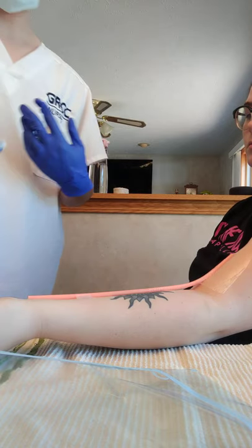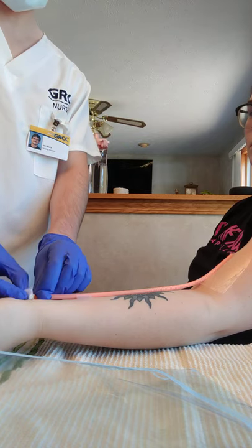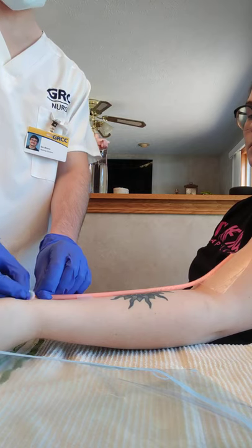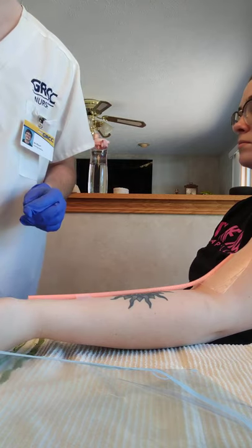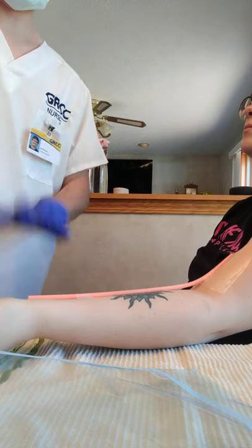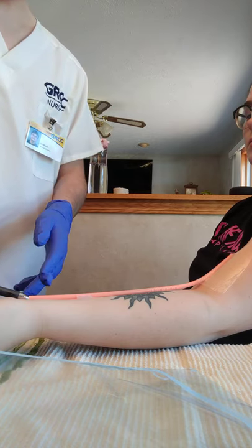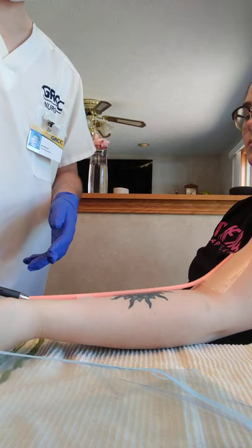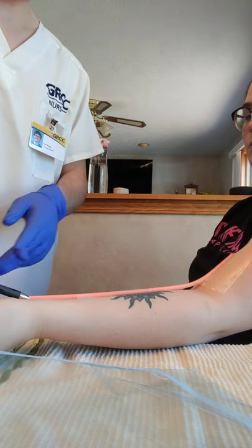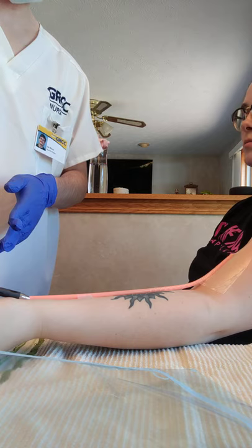Next, I'm going to inject the locking solution. So again, I'm going to clean the port for 5 seconds at a minimum, if not longer. And then I'm going to take my 10 milliliter syringe of locking solution after I've let that dry. So I'll hook this up to the needleless port access device and unclamp the clamp on the catheter and slowly inject the locking solution. So I'm going to do that now.